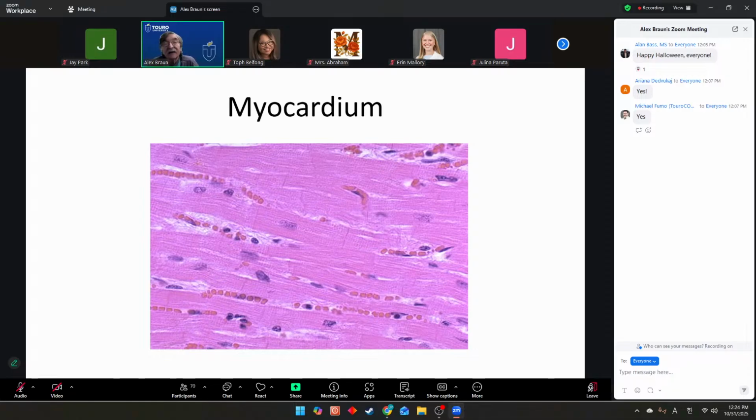In any case, the end-to-end point of attachment of cardiac muscle cells to each other is visible as an intercalated disc. Why is an intercalated disc visible? Well, that's a place where you see multiple junctional complexes between the ends of one cardiac muscle cell and the next cardiac muscle cell. These junctional complexes consist of three main types of junctions: fascia adherens, which is an adhering type junction; macula adherens, which is also known as a desmosome; and gap junctions.